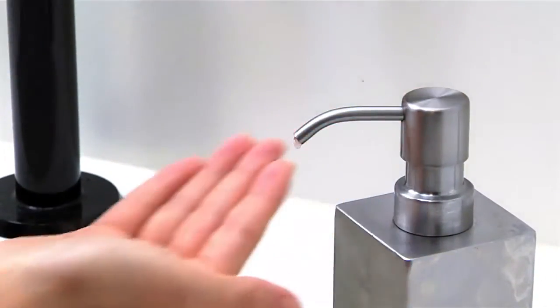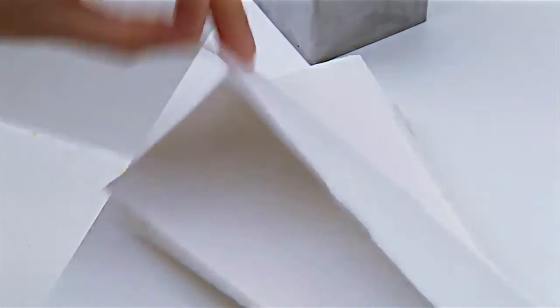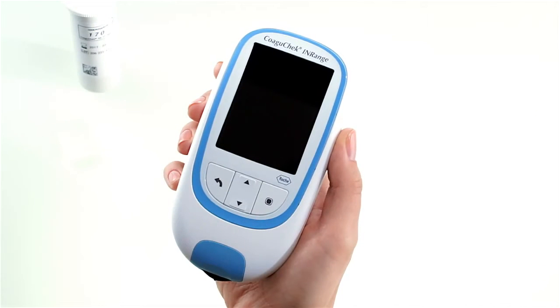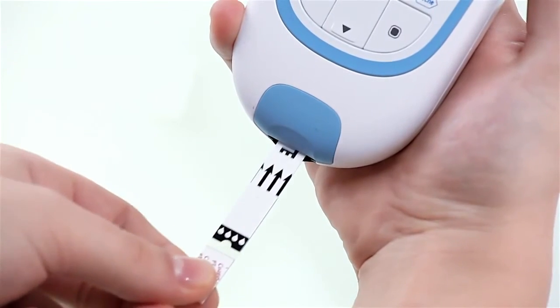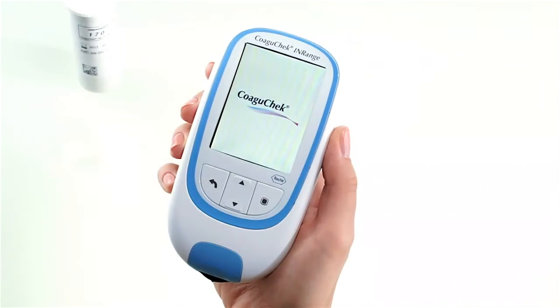To get a suitable drop of blood, remember to always wash your hands with warm water and dry them thoroughly before you test your INR value. Place the meter on a level, vibration-free surface or hold it in your hand so that it is horizontal, like on a desk or table. Power the meter on by pressing the enter button, or you can insert a test strip into the meter.